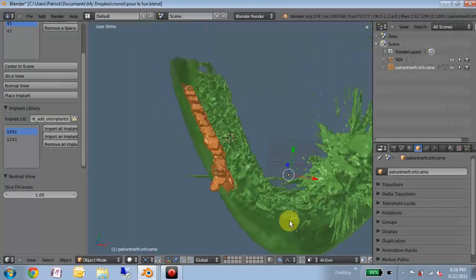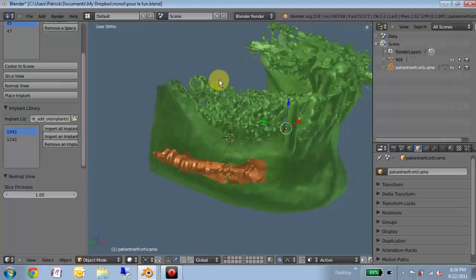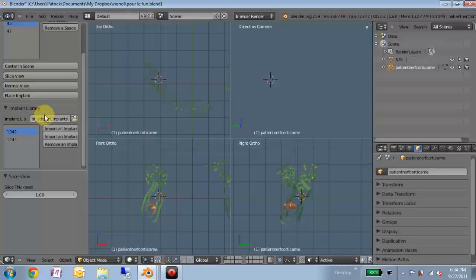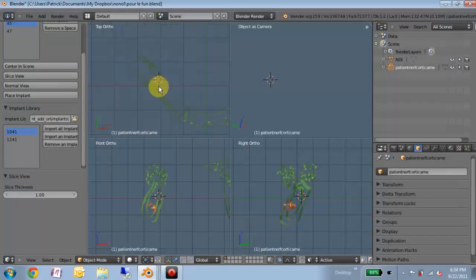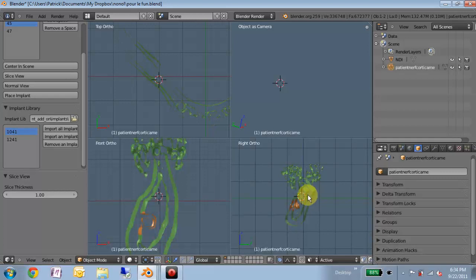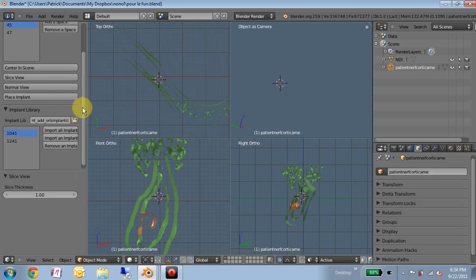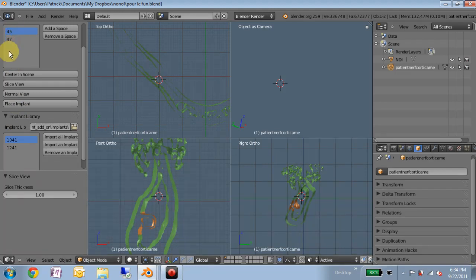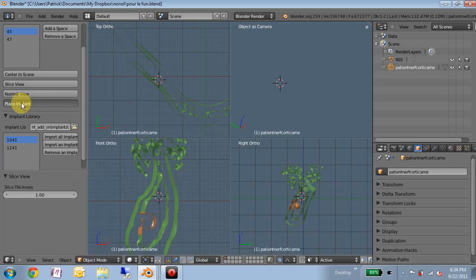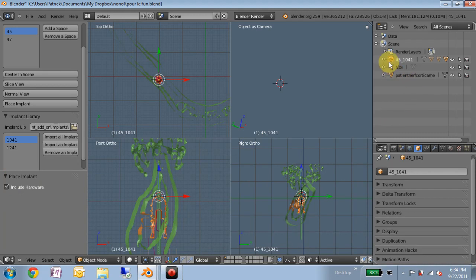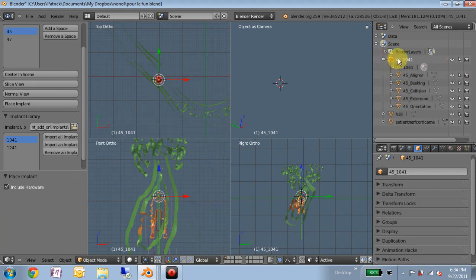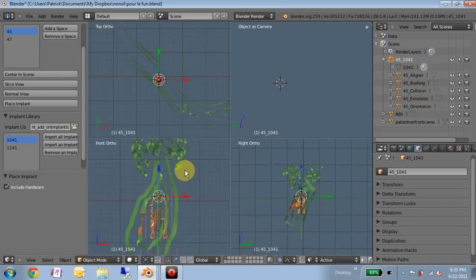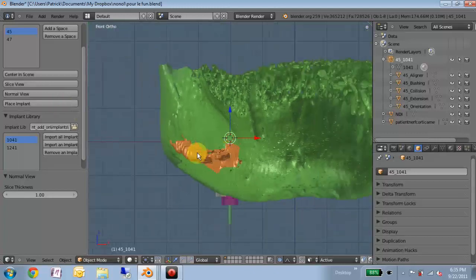Let's assume we want to place an implant somewhere in here. Go to slice view. More precisely locate our placement. Looks fine. And then when I click the place implant button, it will take the implant which is selected here and associate it with the space we have selected here. And we'll also rename it. So if I want to put an implant right here, select 1041, location 45, and we'll place an implant. And we'll include the hardware with it.